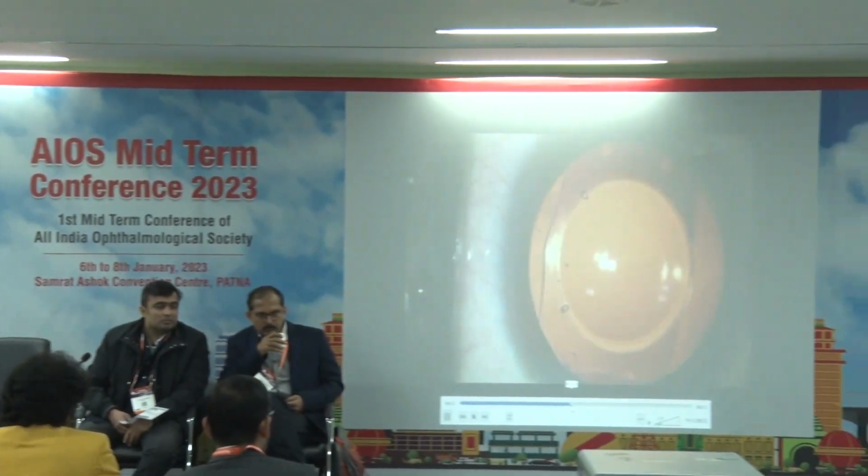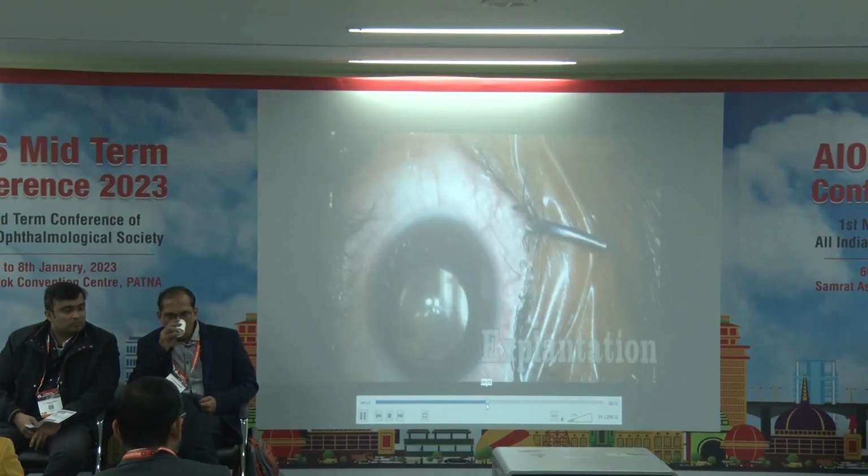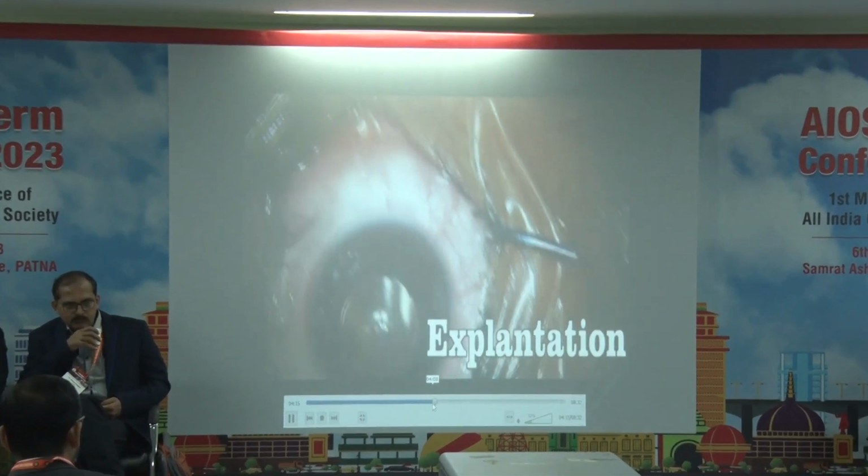Okay, so this is now about a 10 or 12-year-old video. These were the days when we actually did not have a centra flow. So this is a normal IOL and this is explantation of an IOL.